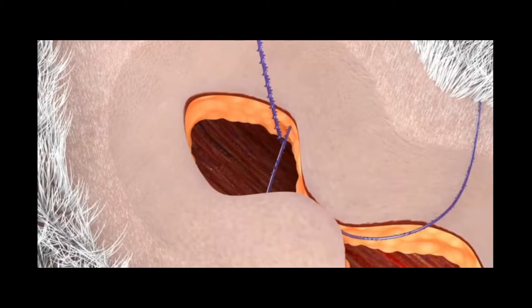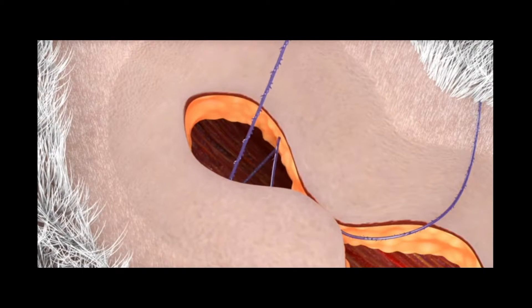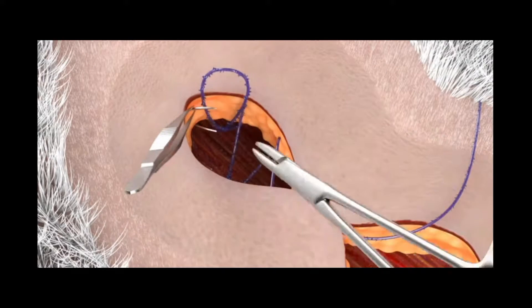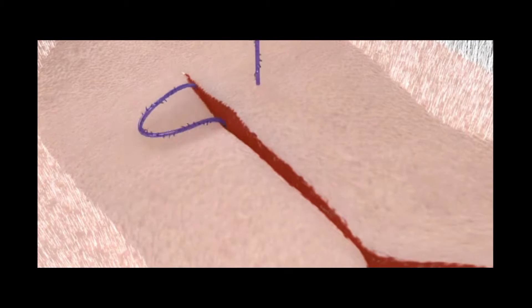So as they're putting that suture in, all they have to do is pass the needle through repeatedly. They're doing like a running skin stitch, and as they're pulling that suture, the skin is closing up behind them. They'll pull and tug on the suture, and those barbs make it so the suture can't retract back through the holes that the needle goes through. I don't see it used very often in any other specialties other than ortho, but it's a pretty interesting suture.